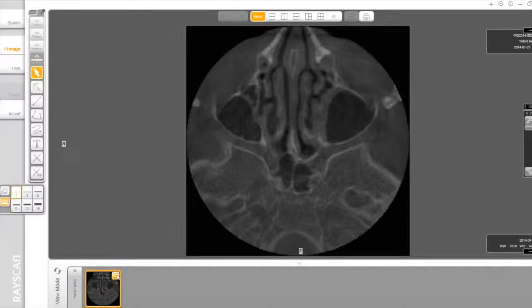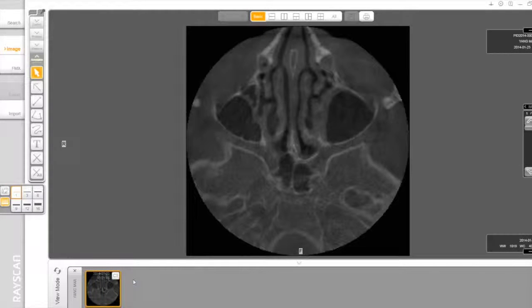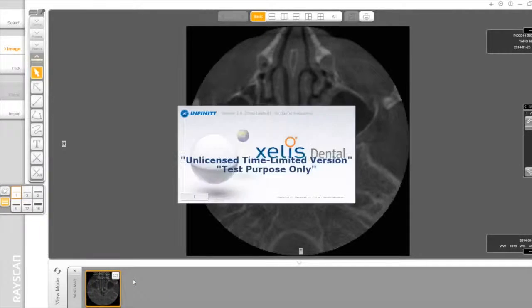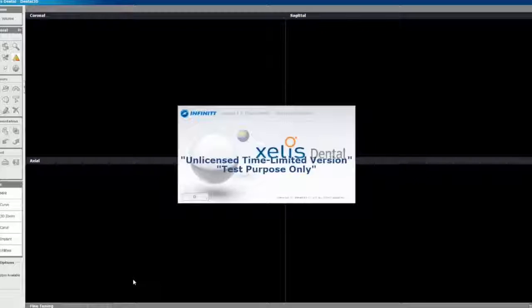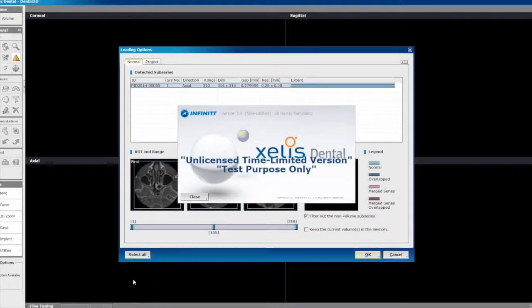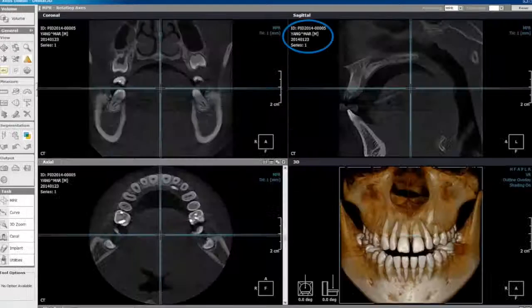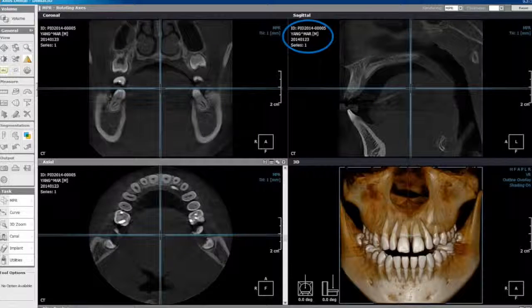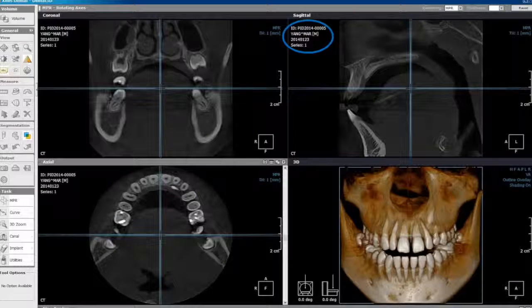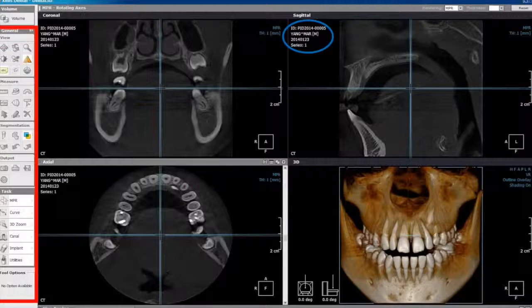Navigating the software. After launching the patient volume from SmartDent, you will notice the information of the current patient on each MPR views. MPR refers to multi-planar reformatting views, and the standard window controls on the left side.